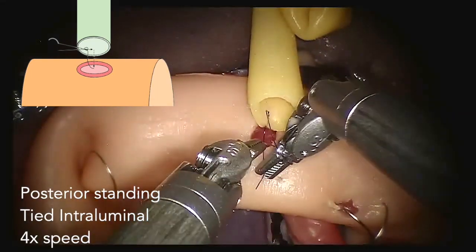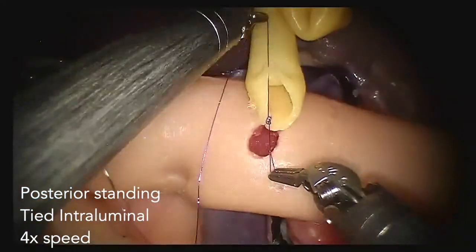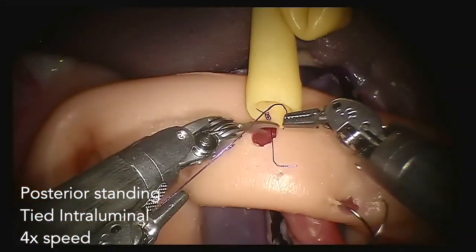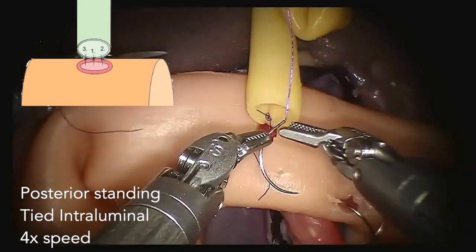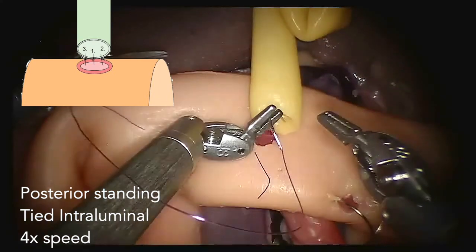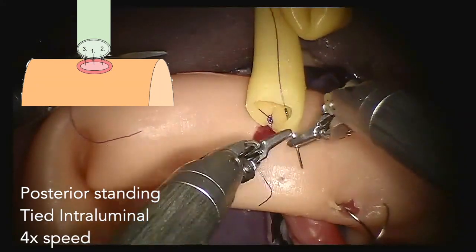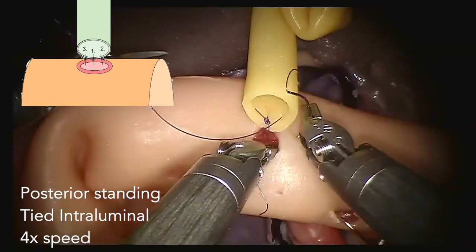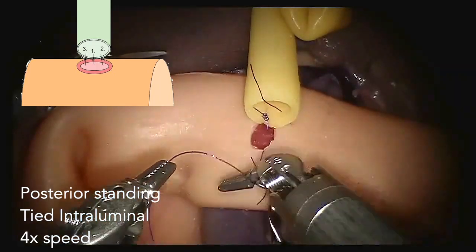For the LearnBot experiments, all hepatico-jejunostomies are made with a monofilament 5-0 suture with a 13-17 mm needle. Driving the needle through these tissues and suturing the knots should be done with great care, since the bio-tissues are very fragile.